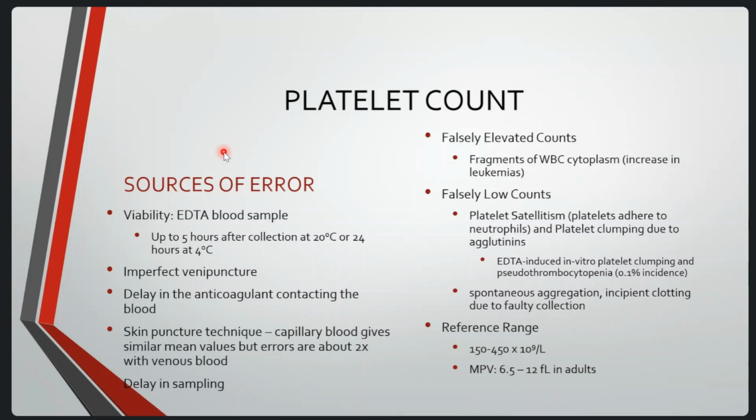Though this is not really rare, it does occur every now and then, so you have to always check your slides under the microscope to check for clumping of the platelets. Because the machine will give you a low result, but under the microscope, there is only clumping, they aggregated. So you have to correct your results.